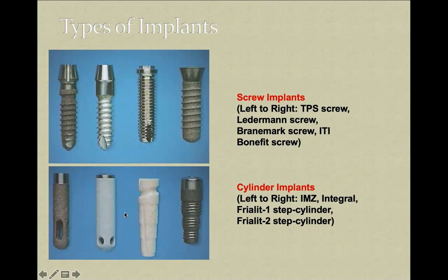In the past, actually, I have to tell you, at the end of the 20th century, beginning of the 21st century, there was a cylinder implant that was just inserted into the bone by means of pressure. That was the reason why they had primary mechanical stability, and they had holes on the side, so bone can grow inside the holes.